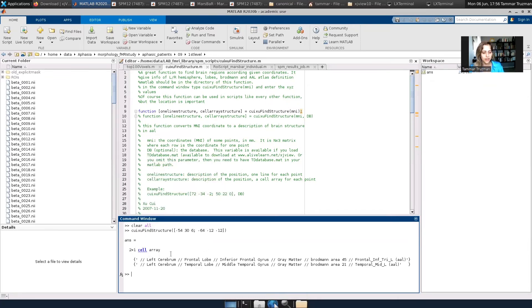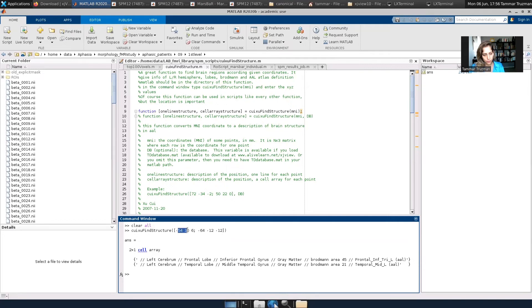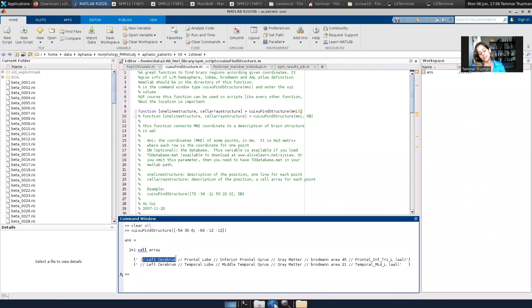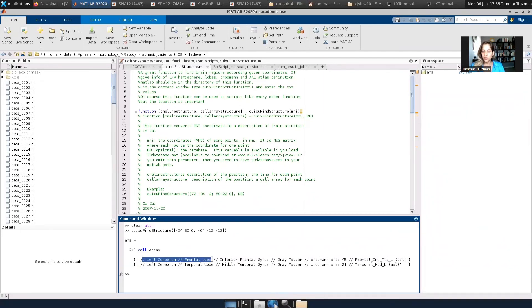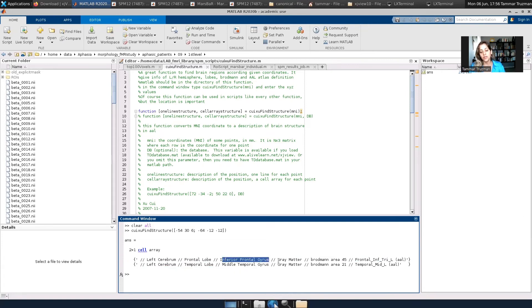Okay, so I get a cell array of two rows. The first one is for the first coordinates of minus 54, 30, and 6. So I can see that it is in the left hemisphere, left cerebrum. It is in the frontal lobe. It is inferior frontal gyrus, gray matter.